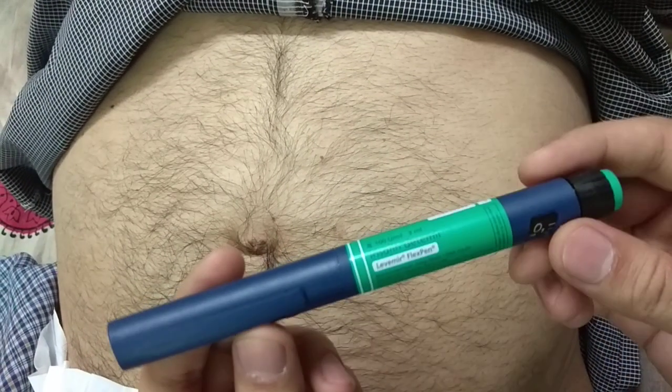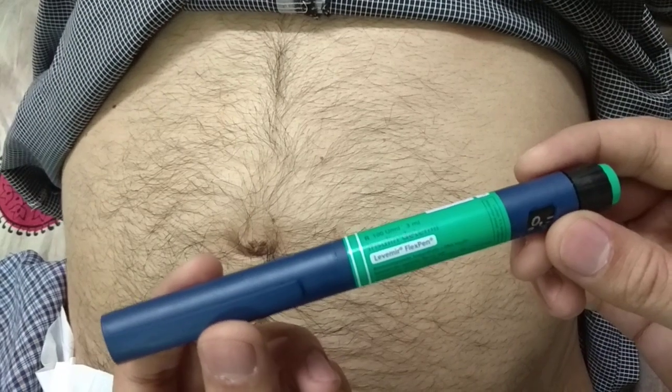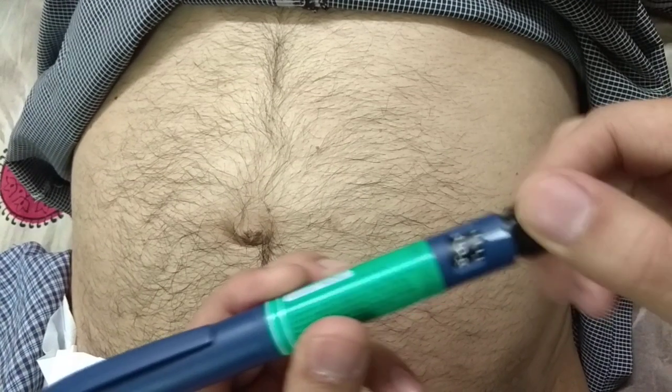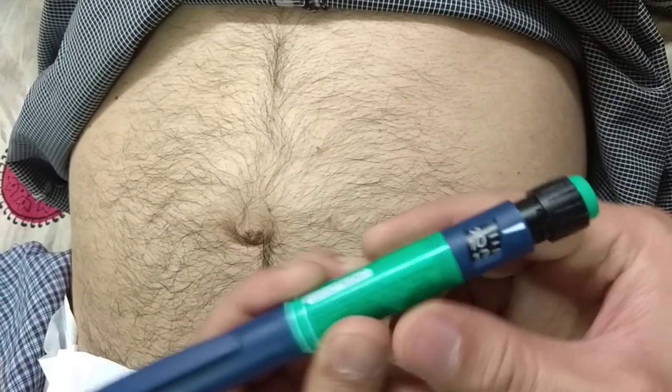This is a small demonstration on how to administer your insulin Levemir pen. First, you need to adjust the dose which your doctor might have prescribed or you might already know beforehand. In our case, it's 10 units of insulin.